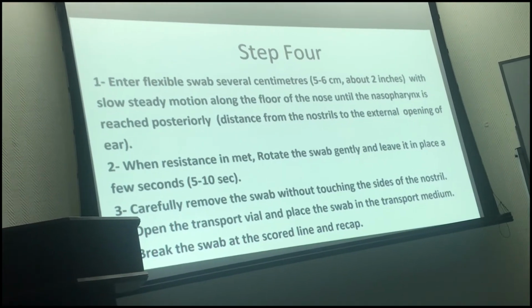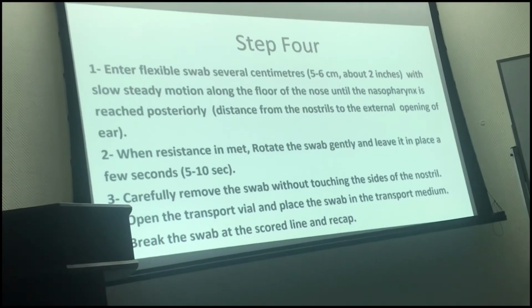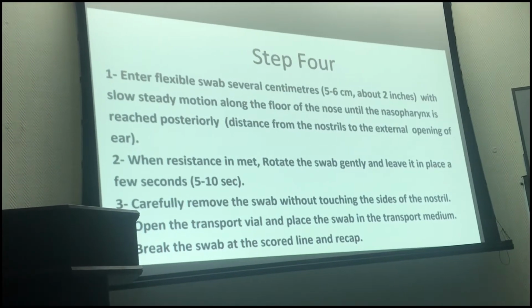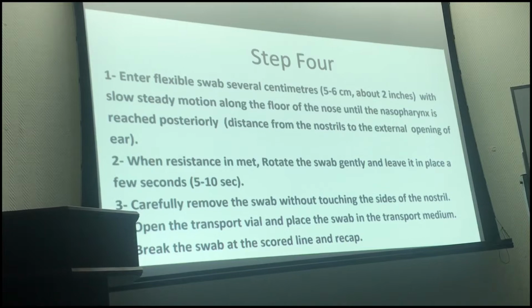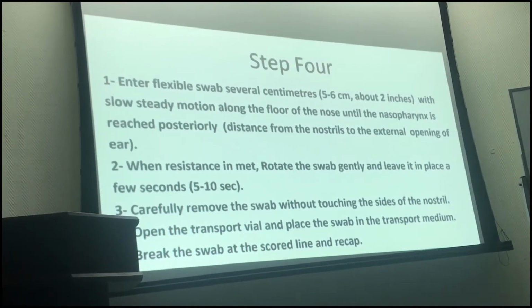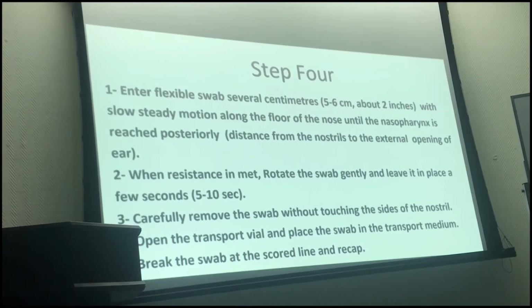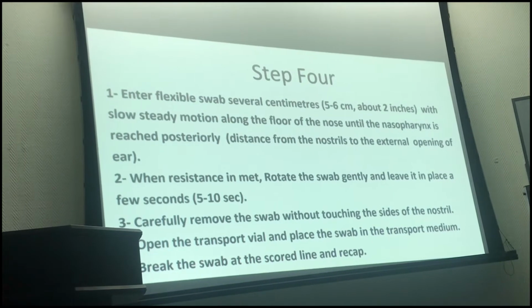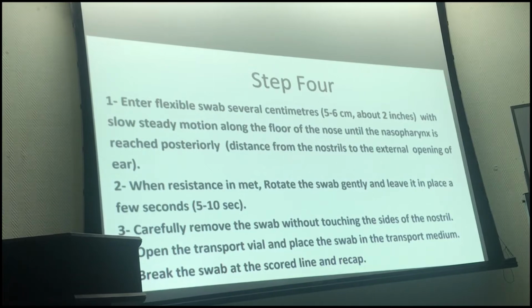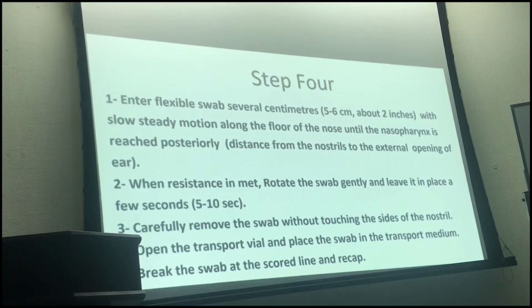So before you insert the swab, you approximate the distance you will insert by looking at the patient's face, and then you hold the swab with your hand at the same distance from the other end. So when you reach this distance, and at the same time you meet a resistance, then you are sure you are in the nasopharynx.